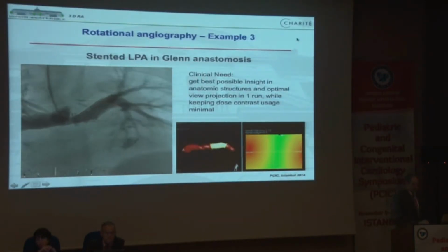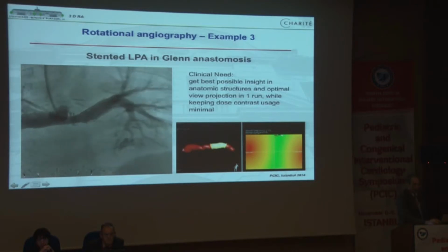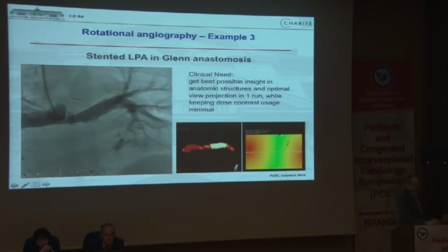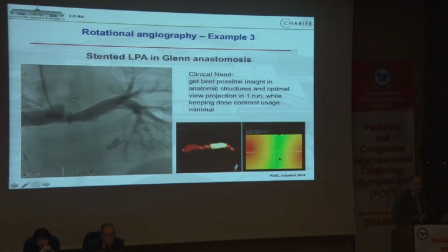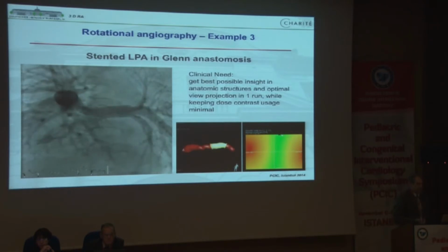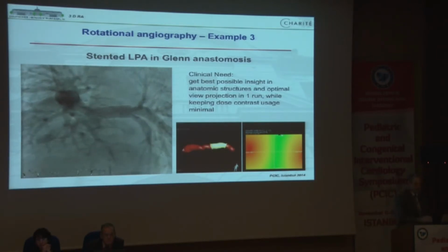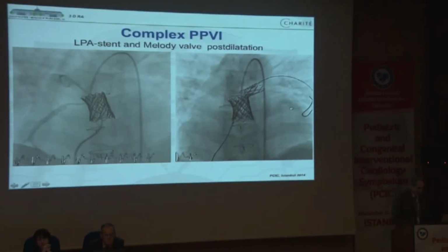And in this regard, you can rule out which angle is indicated with the green zone here in your 3D modeling. If the projection or the angle of your machine is within this green zone, you can make sure that the foreshortening of your measurements is minimal, if not zero. So that is very helpful in this regard.